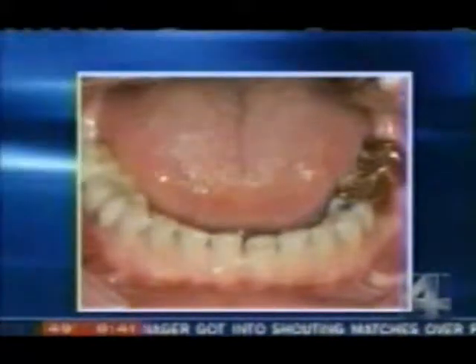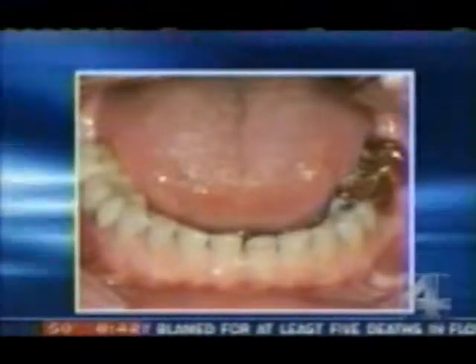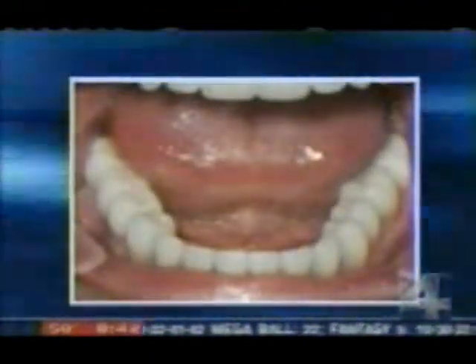Okay, that was the back of the mouth. We have some examples, too, of the front of the mouth. And, of course, that's the part that people see. Now, if you look on your right side of the screen and then the back left, we've got 2 different types of restorations and then a lot of wear across the front. This is a little bit misleading. We've got 2 gold crowns in the back and then a 3-unit porcelain bridge on the back left. Ton of wear. This actually was a full mouth patient we did. A full mouth? We treated every tooth in the mouth, and we've got all the pictures here.